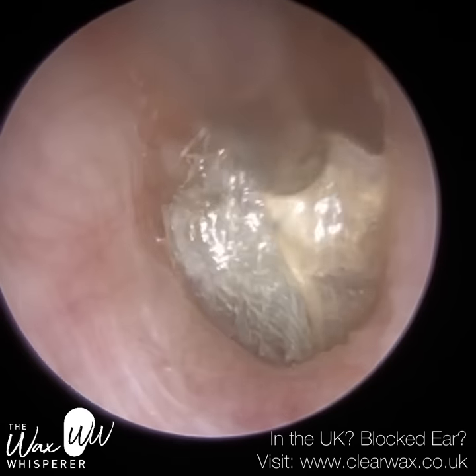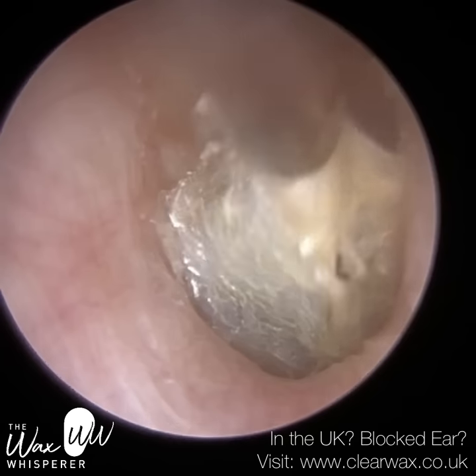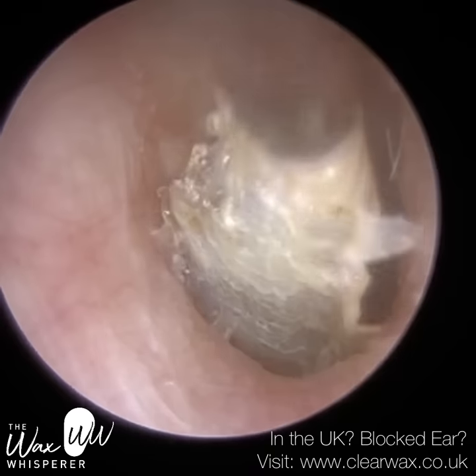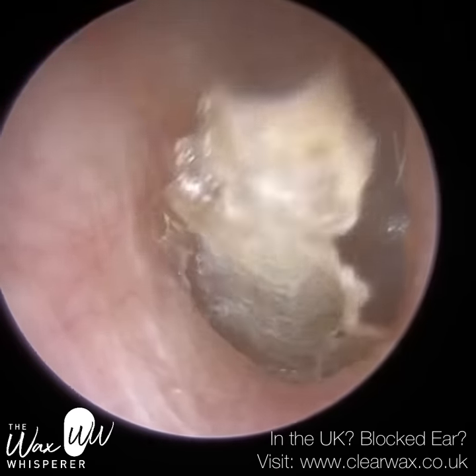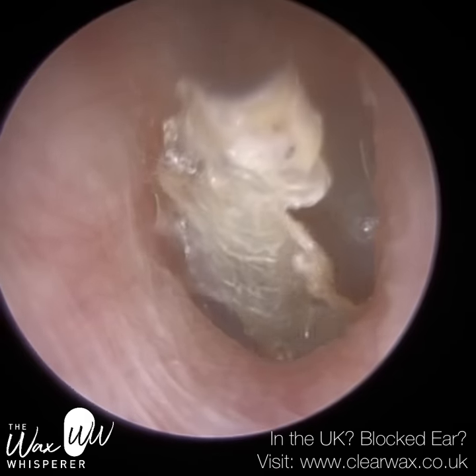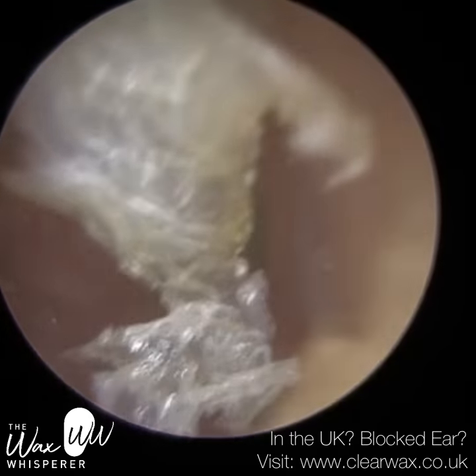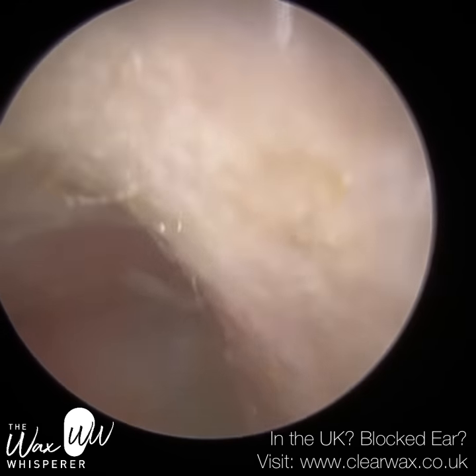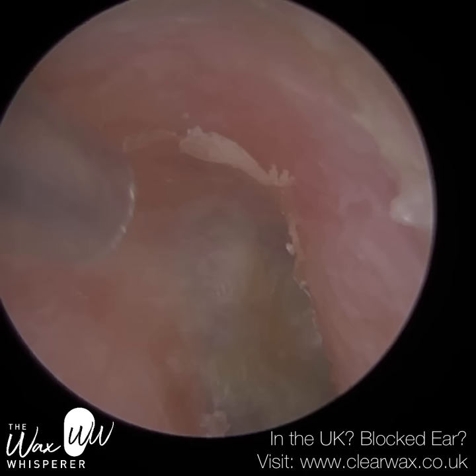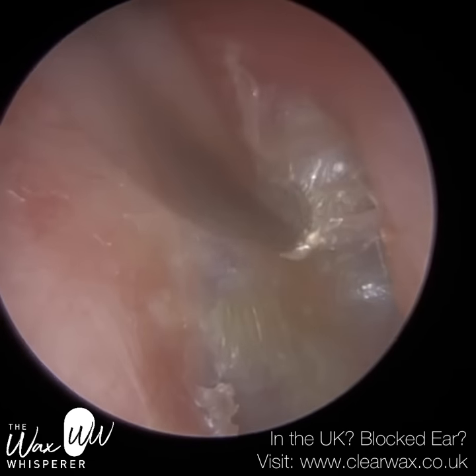It's just this at the bottom — that's the inferior recess where we're working now. That skin goes down into the little trench basin. I'm just wriggling it left to right. Using forceps this deep would be difficult with this patient because the ear is quite narrow — although they're micro forceps, there's very little room for manoeuvre. But we are succeeding with the fine end, so I'm just continuing. You can see that skin came away from the inferior recess. This remaining skin is all from the anterior recess, and I wasn't able to get all of it — the patient found it slightly uncomfortable, so we left it.